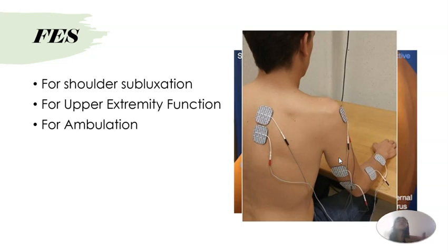When we talk about FES, in NMES you just put it on and stimulate the muscle, and after that, okay. With your FES, aside from the stimulation, we incorporate a certain activity. That's why it's called FES. We'll discuss that more during our lecture.